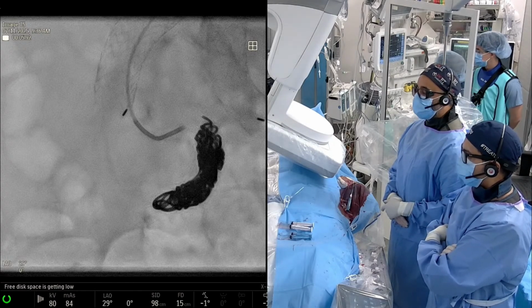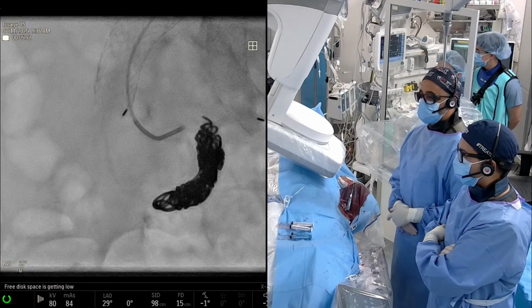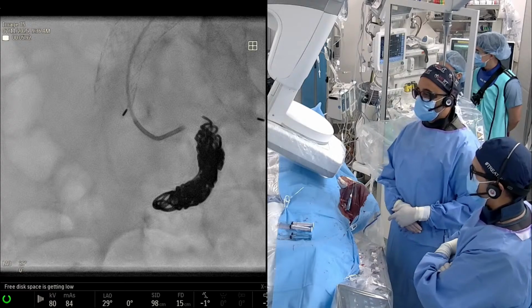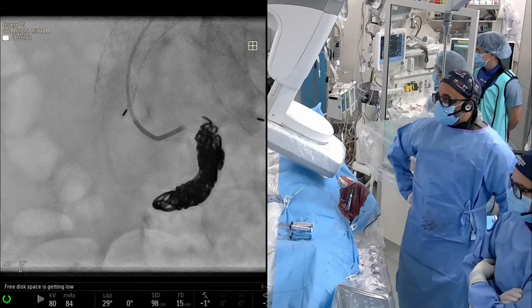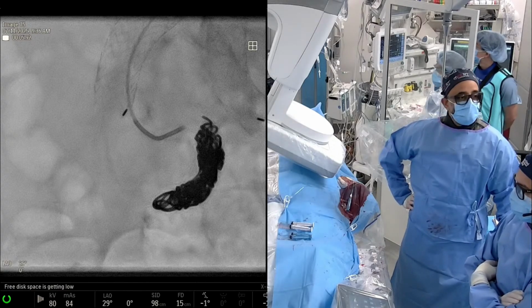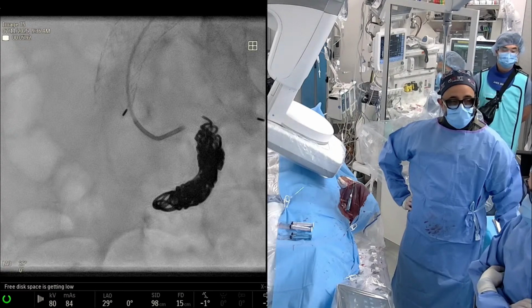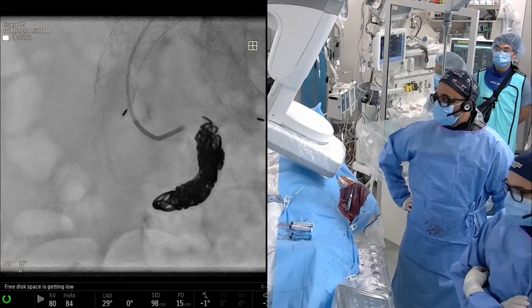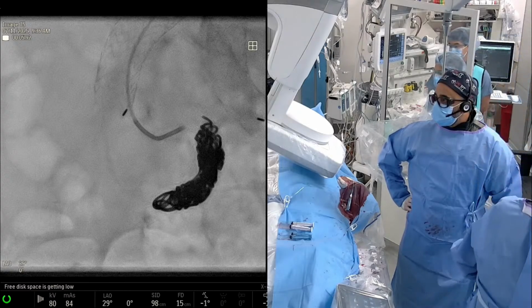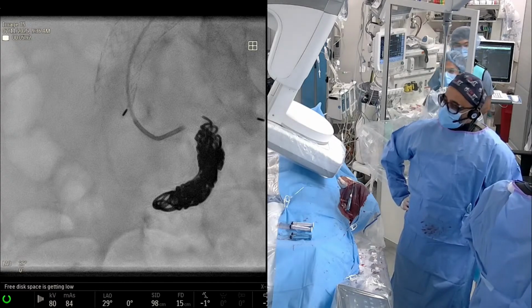Yeah, exactly. I think you get into the interstices and then fill in the spaces, because it's still going to have space between those 030 diameter things, and you fill it with some much softer stuff. It doesn't even have to be long. Can I get a 2.8 Prograde 150 and a 60 regular packing? Yeah, I don't even know if you need length. You just need to fill the dead space. Actually, I think we have enough space.